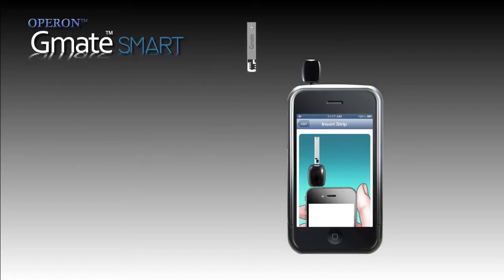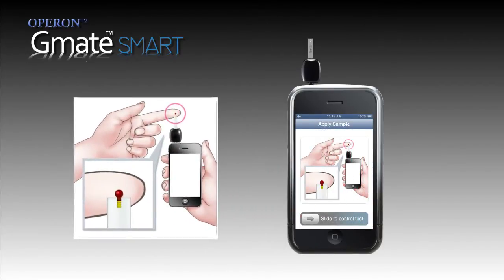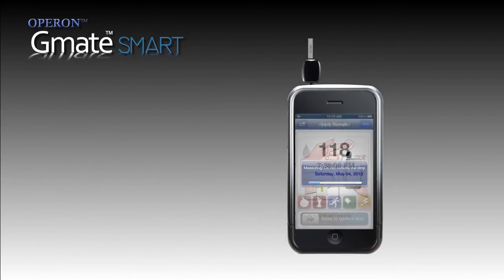Insert the strip as illustrated and apply the fresh finger prick sample on the strip. The strip automatically aspirates the desired blood volume and in 5 seconds you will get the blood sugar reading on display.